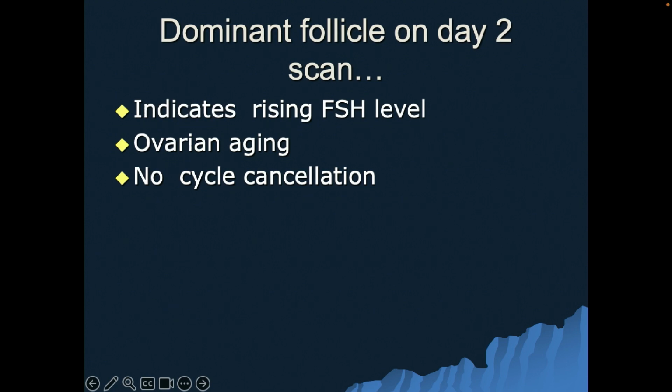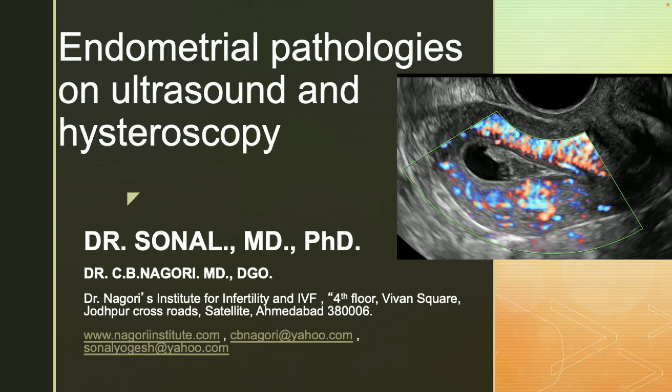If I talk about the follicle which is early recruited, and if it is an IVF cycle, remember that if you have multiple follicles growing in the cohort, you can ignore that follicle and wait for the rest.